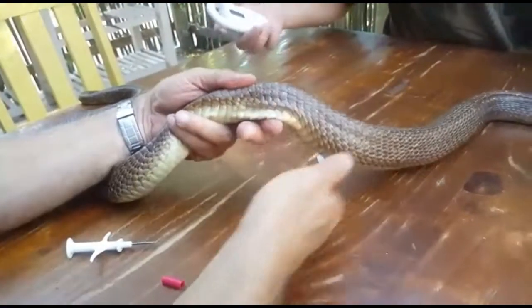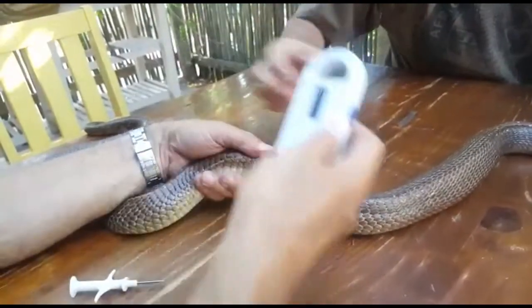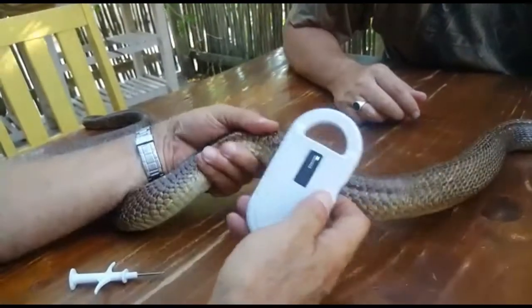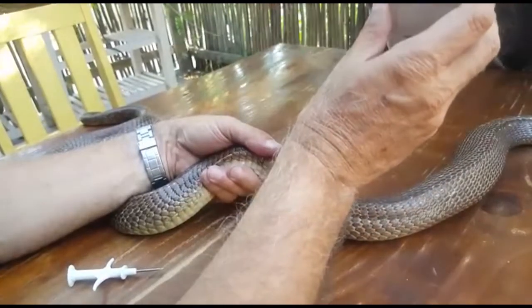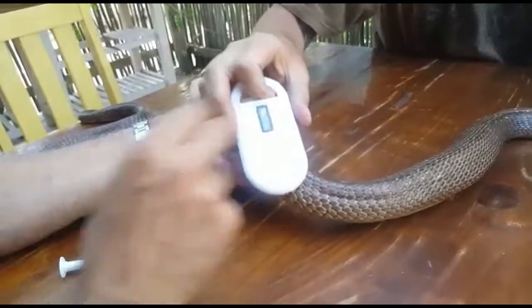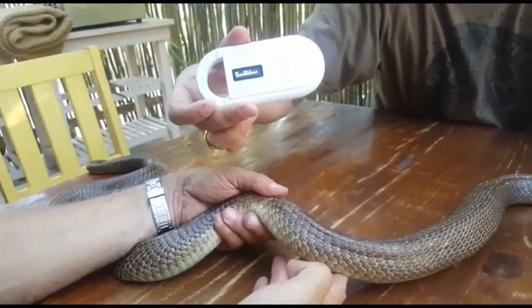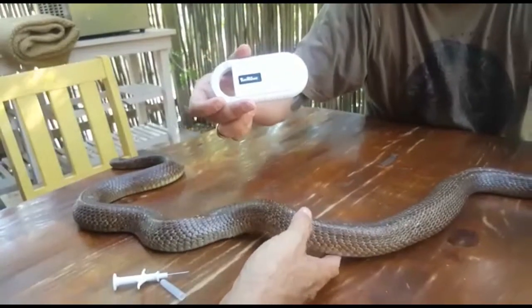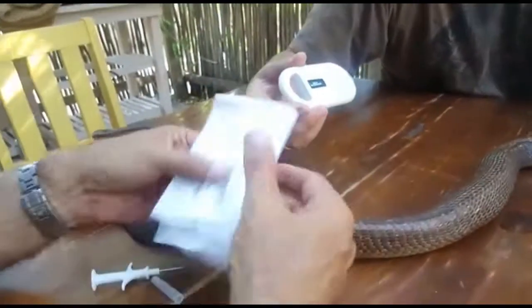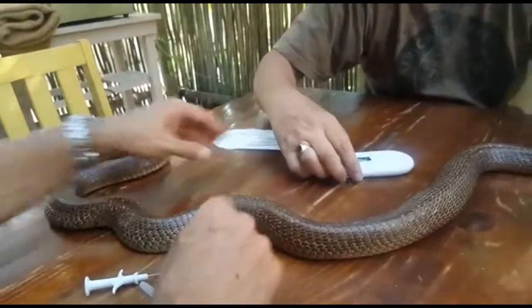Right, let's just see if we can — and there we have our number, beautiful. It ends with 47, and if we look at our label, it ends with 47. Perfect, one done — bring us the next.